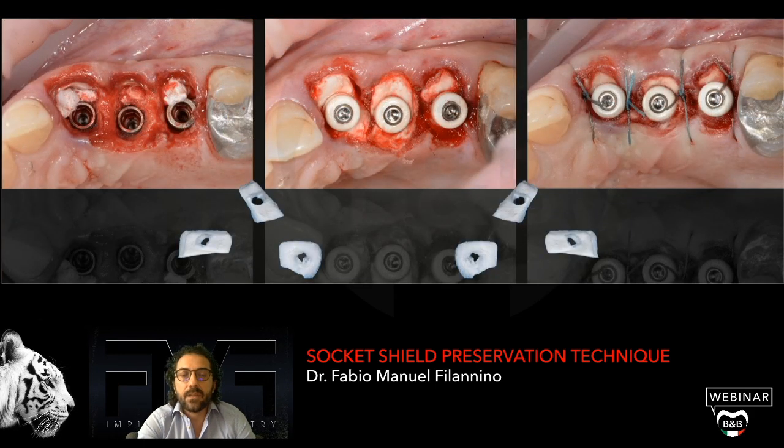And then I used the root membrane technique, so I inserted only collagen, pressed collagen, to perform a poncho technique that my friend Alberto Miselli always used, and I was able to screw these healing abutments that are conical healing abutments with a conical connection. So you reach the first stop and then the second stop to go through the conical connection.